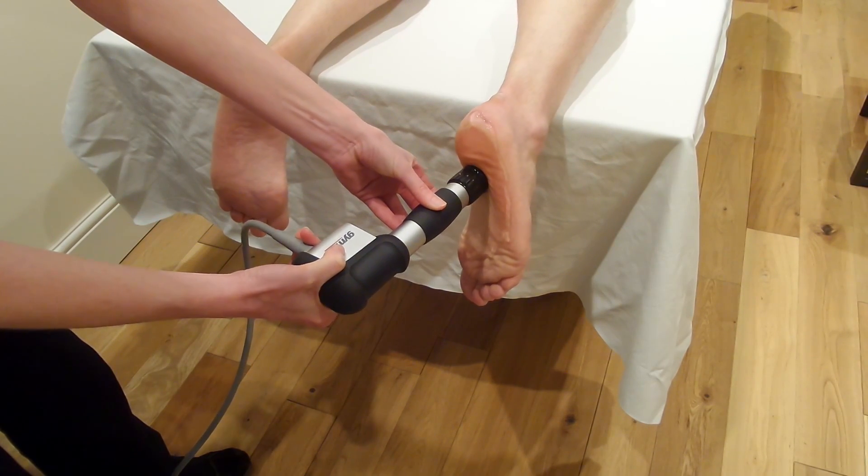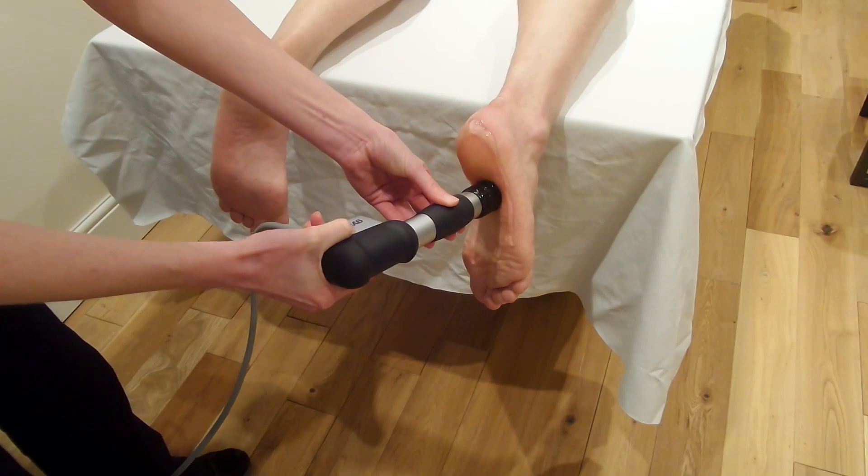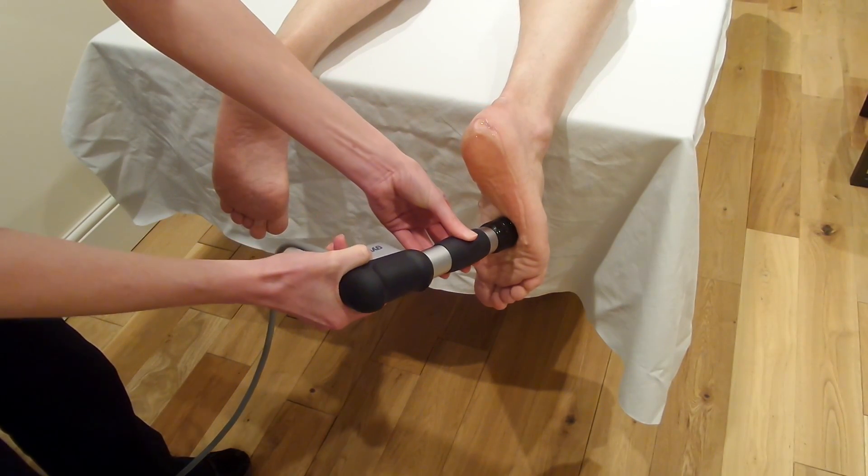Keep going here until we hit the 2000 shocks — and that's treatment of the plantar fascia with the head moving.